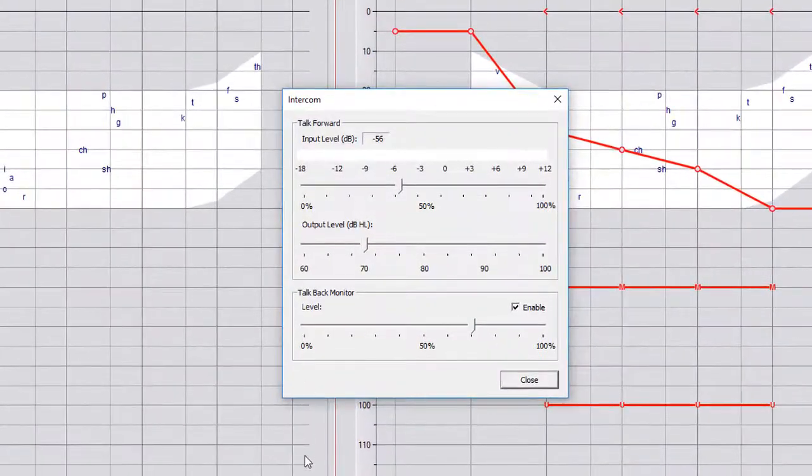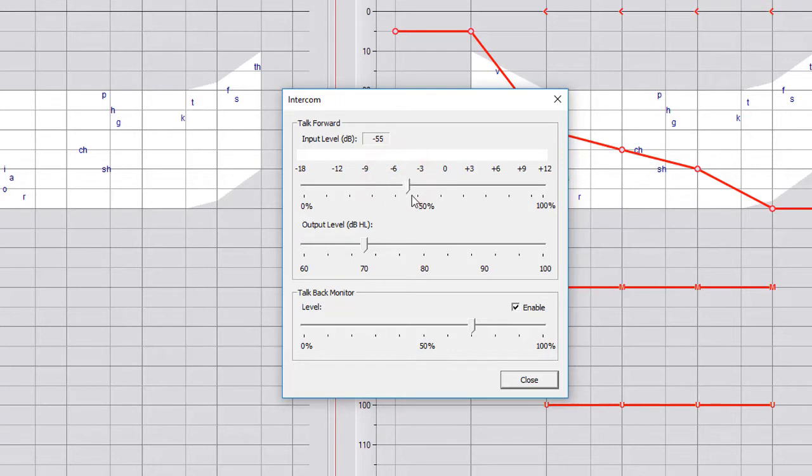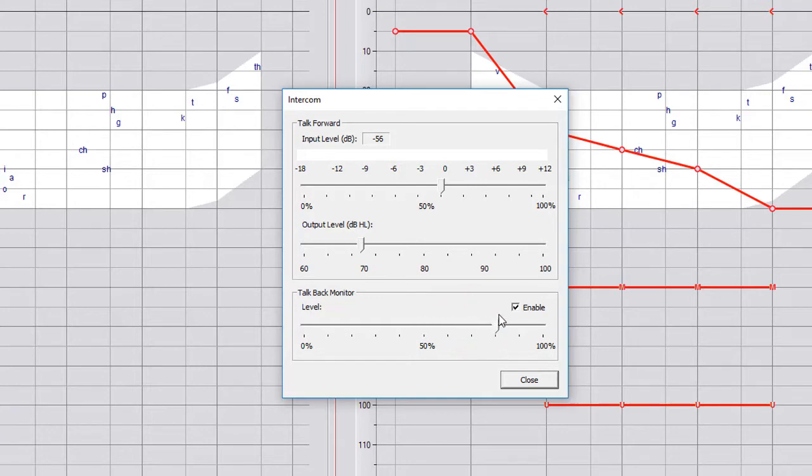Under the talk over window, you can adjust everything and it's going to change daily and even per patient. So you have your input level, which is your voice going into the microphone. The output level is how the patient is hearing you and DB level or DB hearing level. And then the monitor is how you are hearing the patient through the talk back mic. So if they're very soft spoken, you're going to have it up a hundred percent.